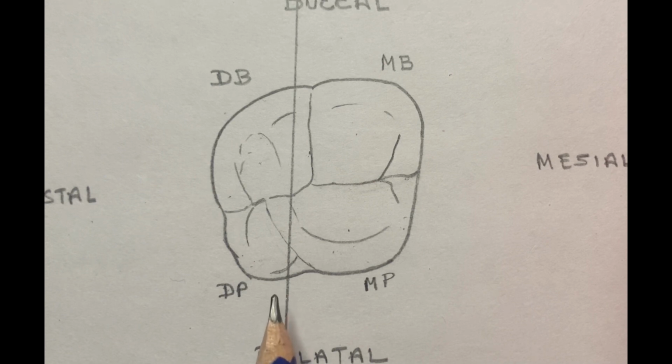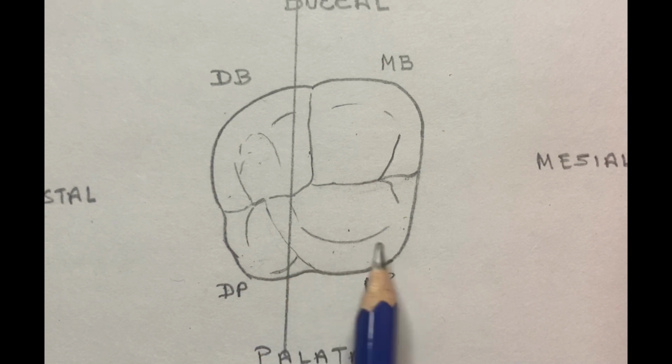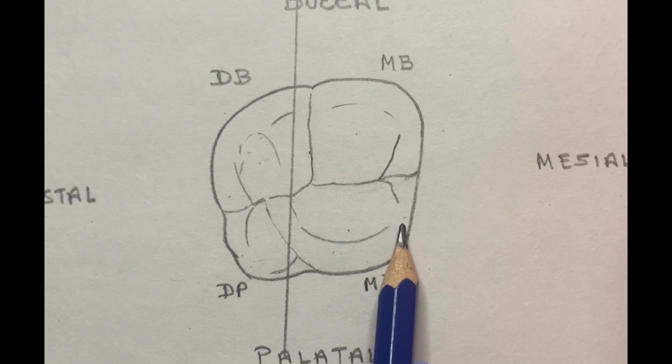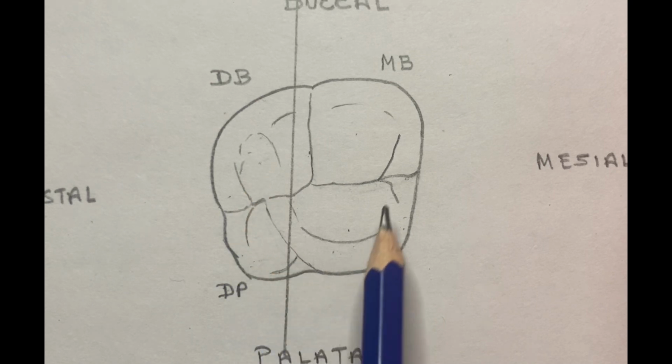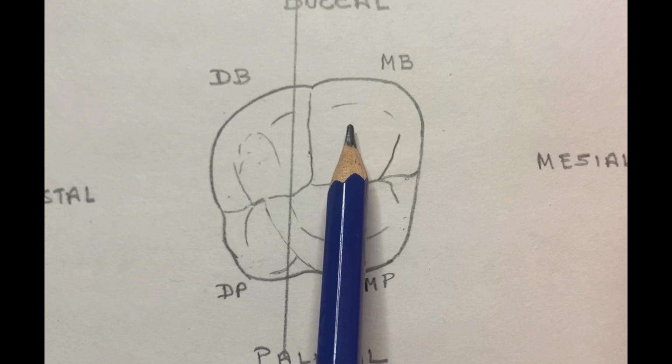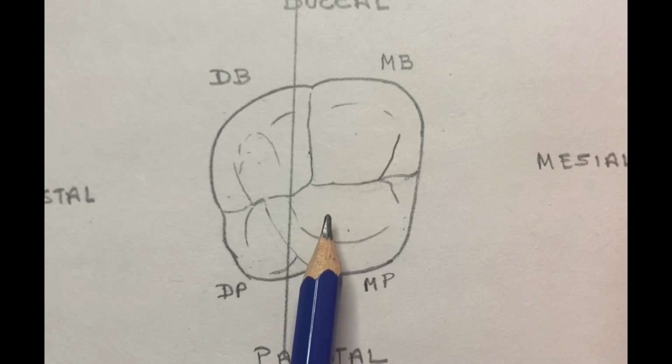The access cavity is made in the mesial 2/3 of the tooth. And when we make the access cavity, we keep in mind that we do not disturb the oblique ridge, the mesial marginal ridge, and the mesiobuccal cusp tip. Now the shape of the access cavity, it follows the shape of the pulp chamber.